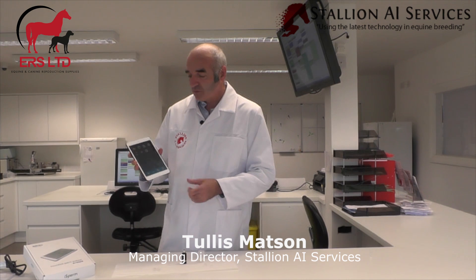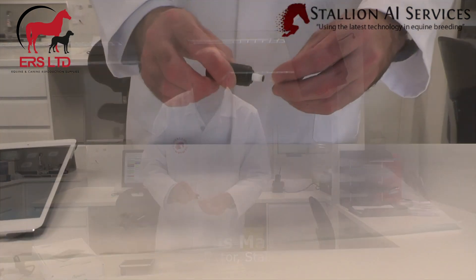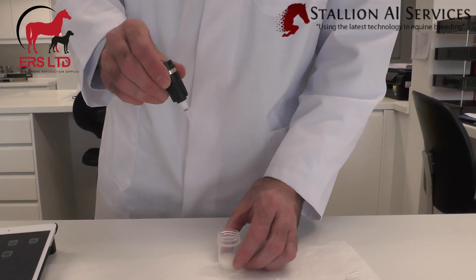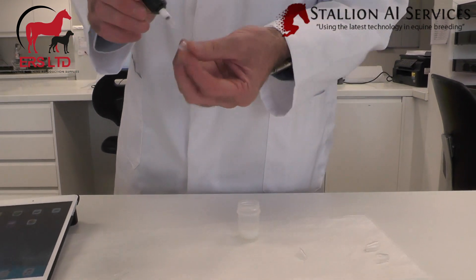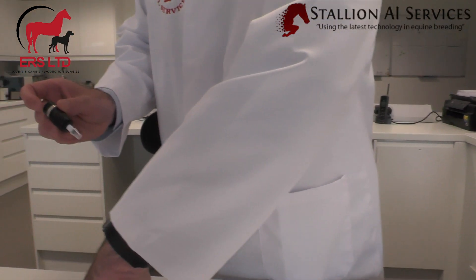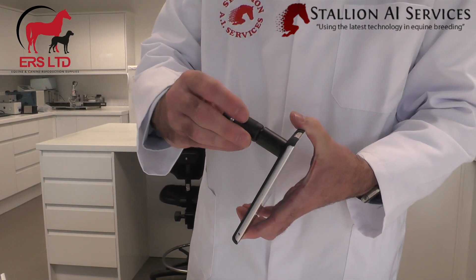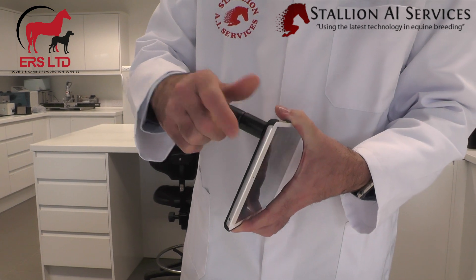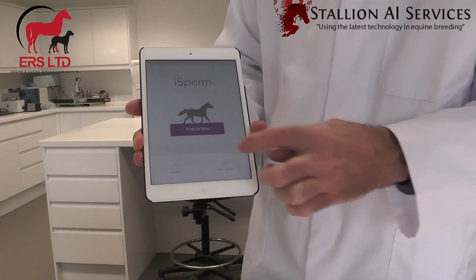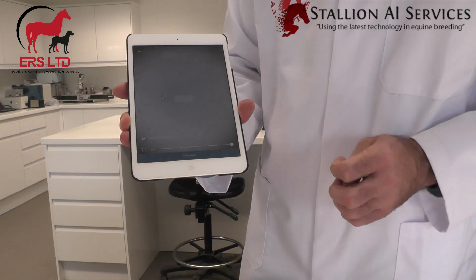With this piece of apparatus, we put one of these chips on the end, put it into our semen sample, put one of the caps on the end. It has a little light that we switch on, and we put it at the back of the iPad. Then we just turn on our equine app.